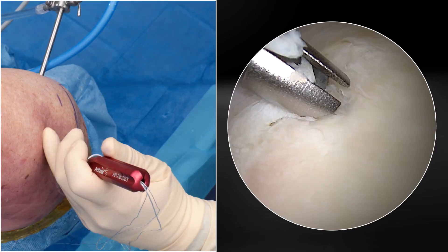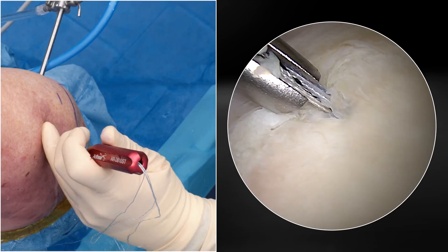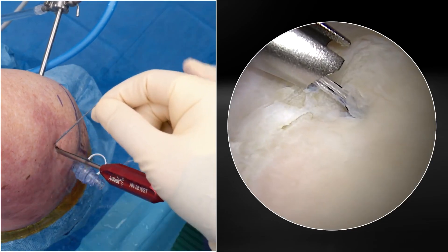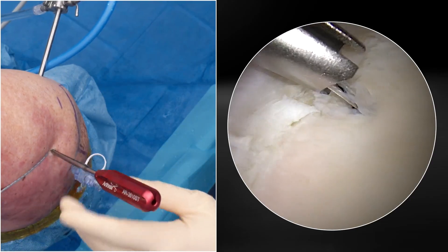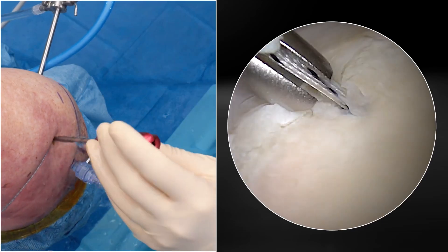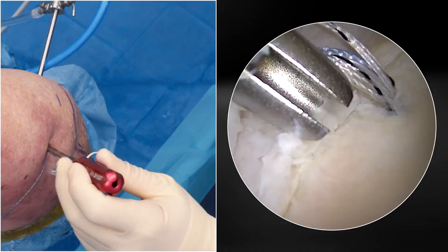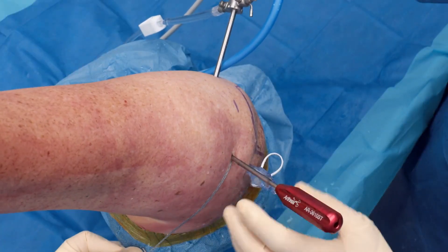At this point, most surgeons will have the urge to remove the guide outside of the joint and prepare for the next anchor, but this adds time to the procedure. With the slotted guide, we can leave it in place and disengage the sutures from the guide. Simply remove the sutures from the outside of the guide and hold tension on them while rotating the guide 360 degrees to confirm that the sutures are fully removed from the guide. Then clamp the sutures outside the body to prepare for the next anchor.